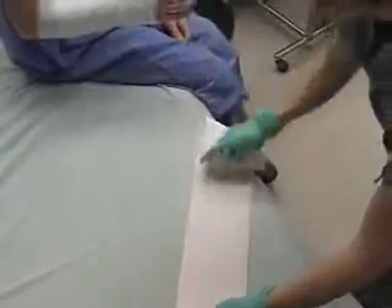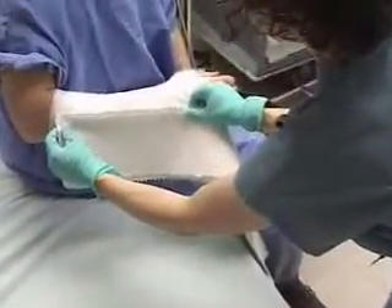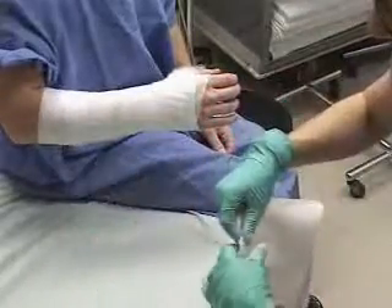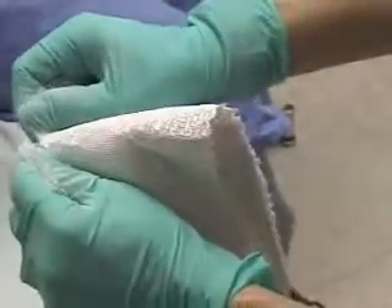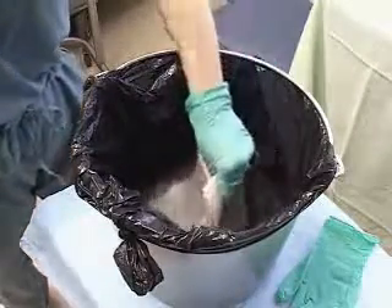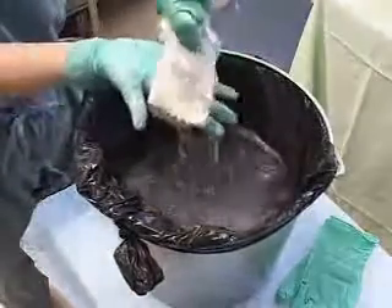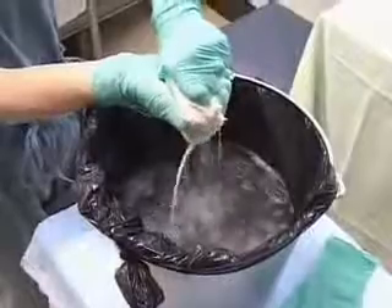The simple volar slab will require 8 to 10 layers of plaster slabs. We measure for length against the arm and tear to fit. The plaster slabs are immersed in the warm water and squeezed in a rough accordion. The less water in the material, the more quickly it will dry to shape.